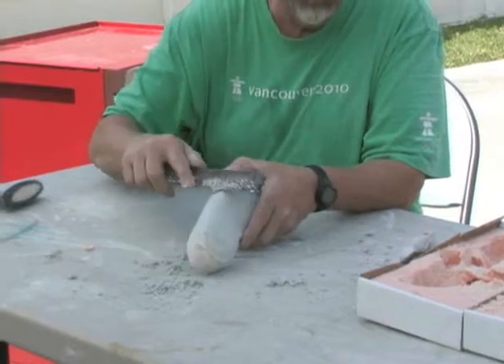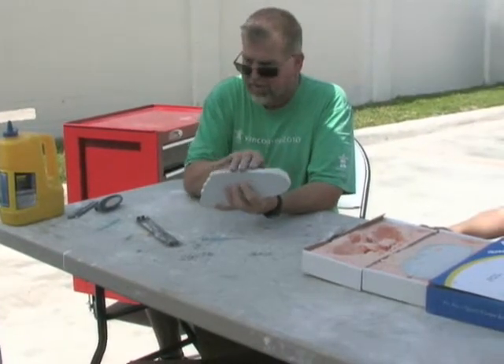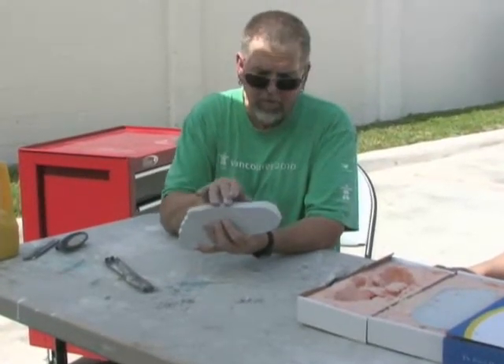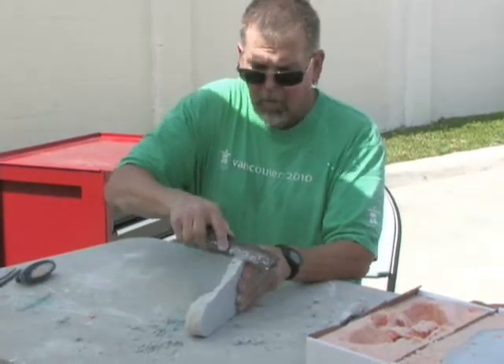I'm putting very little pressure on the file, a little bit more pressure on the sides. Now you'll notice it's not wavy, it's not cut in — it's a nice smooth edge all the way along the meat of the lateral border. I'll turn it around and do the same thing along the medial border.